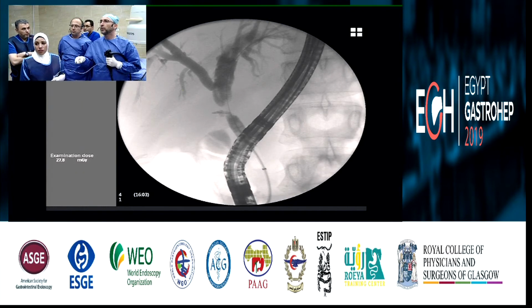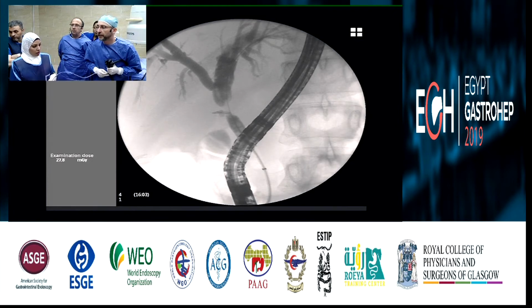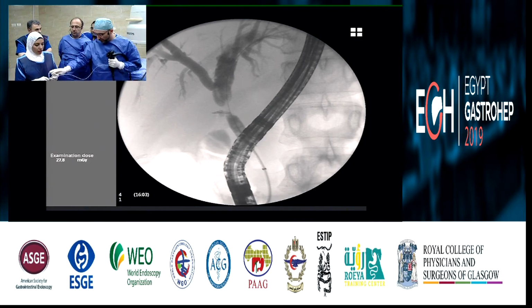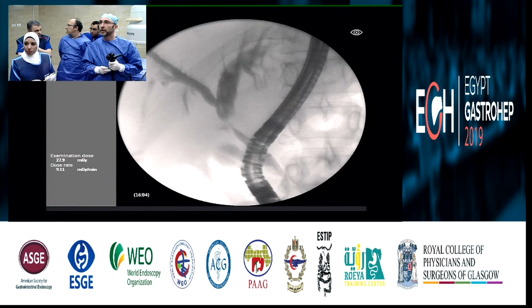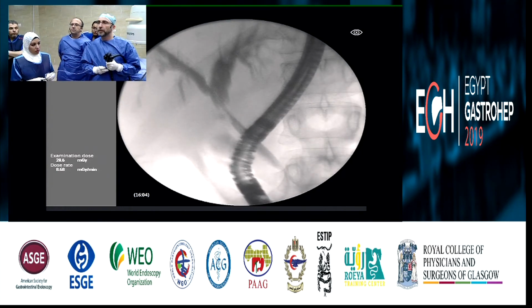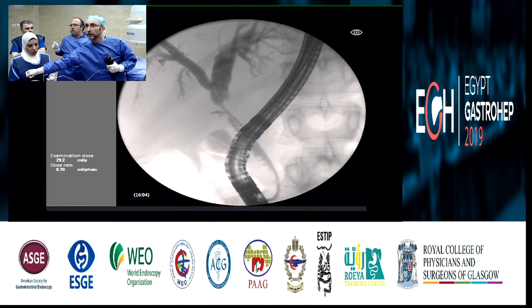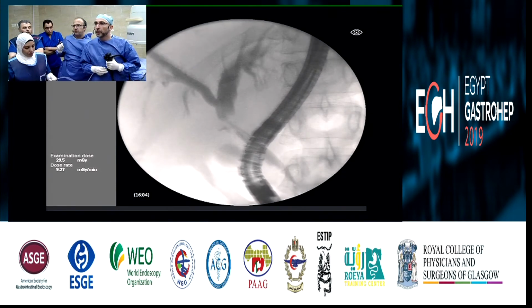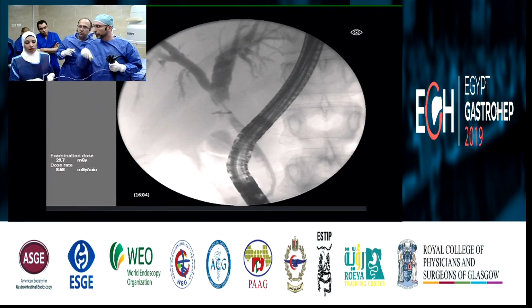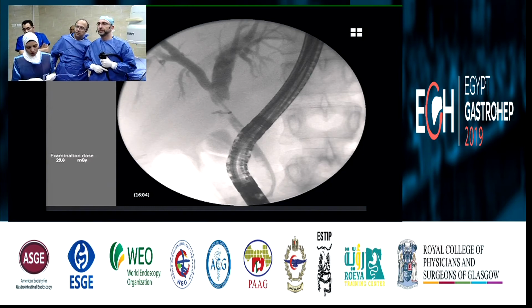Yes, deflate. I would like to place a stiffer wire. What length of metal stent do you choose, or will you measure to estimate? We will place both, 8 centimeter plastic and metal. I think 9 will be better. 12 might be a little bit too long. You want a 12 or a 9? We will measure. 12 could be okay.